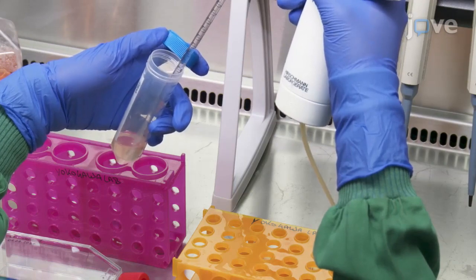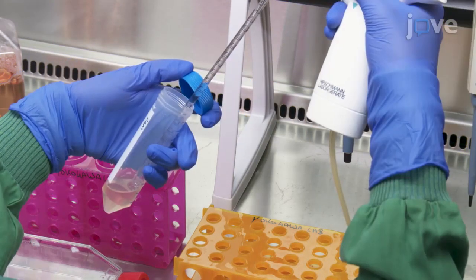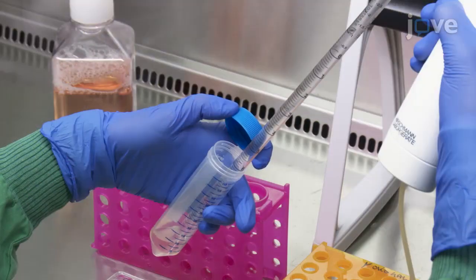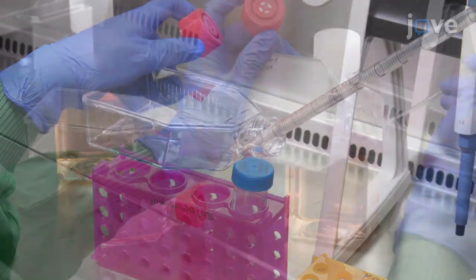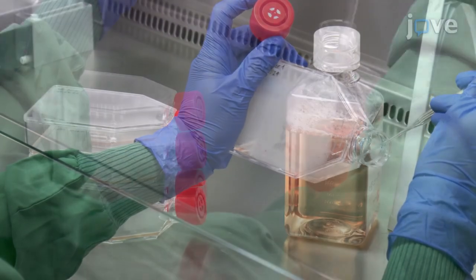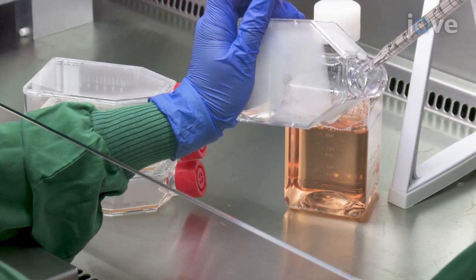For optimal cell retrieval, rinse the cryovial with 1 milliliter of FGM and transfer it to the centrifuge tube. Gently re-suspend the cells and transfer into a cell culture flask. Replenish FGM every other day for 5 days or until the cells have reached 80% confluency.